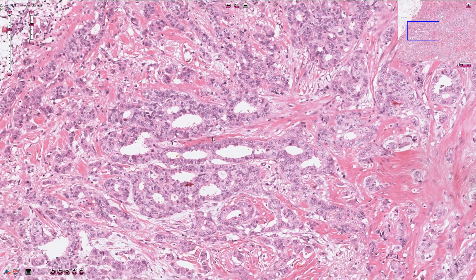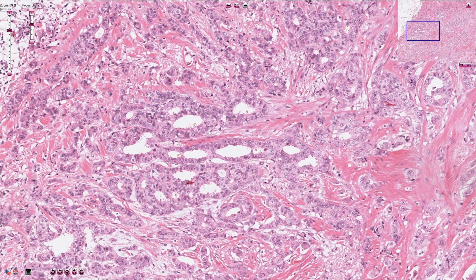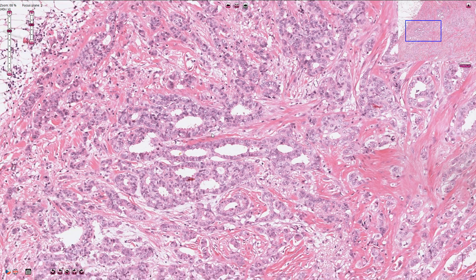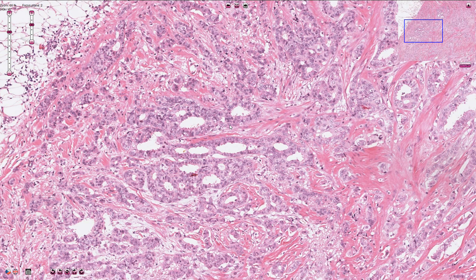We also need to run immunohistochemistry for estrogen and progesterone receptors and for HER2. The results are quite important for the subtyping of this tumor.